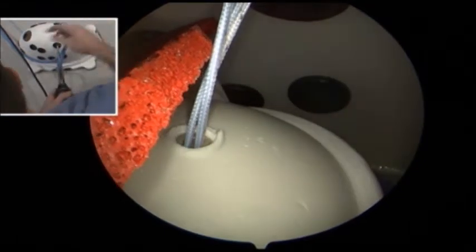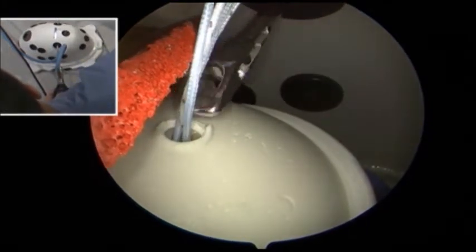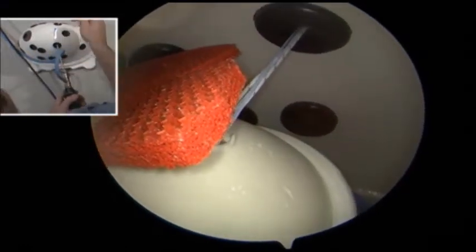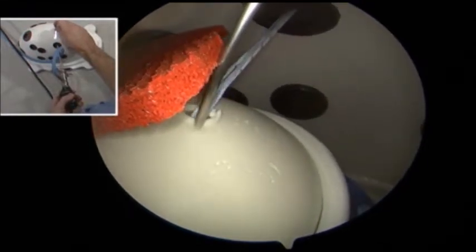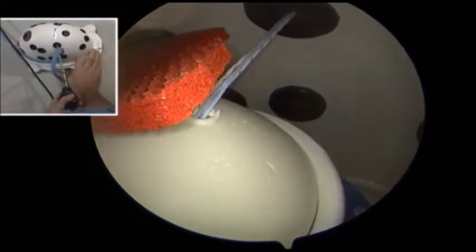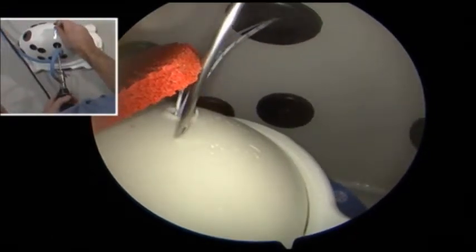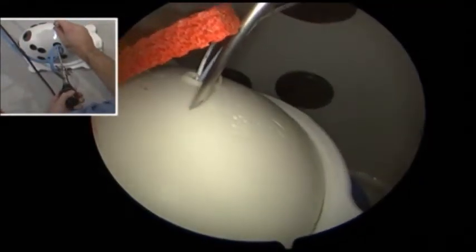And we're going to place another anchor more posteriorly, and so we're going to retrieve our sutures out in anterior suture retrieval or suture holding cannula here. And again, we're going to do the same thing. We're going to insert our spinal needle through the accessory portal and see where we would like to place our suture. If we don't exactly like the access that we have, you can always move the dial on the workstation. This is like internally or externally rotating the arm to give you better exposure. And that looks like about the position that we would like here.